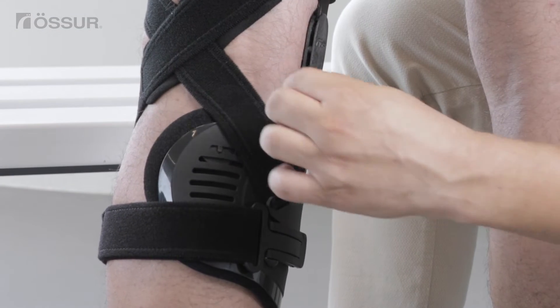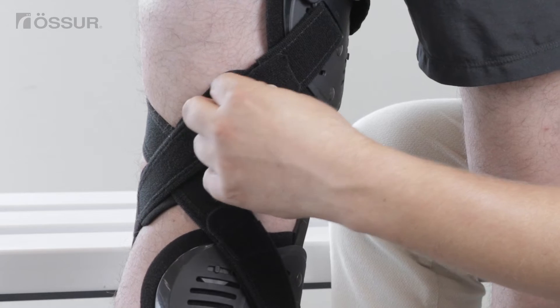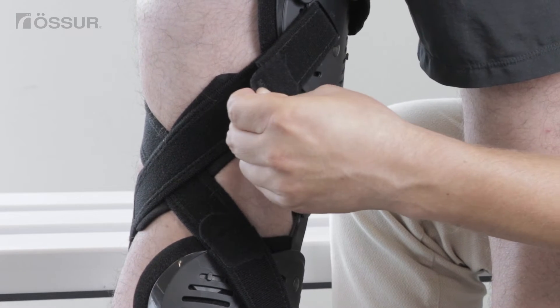Adjust the lower cartilage protection strap length using the alligator clip. Adjust the upper cartilage protection strap length using the alligator clip.